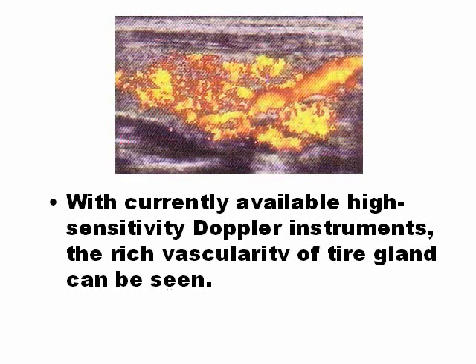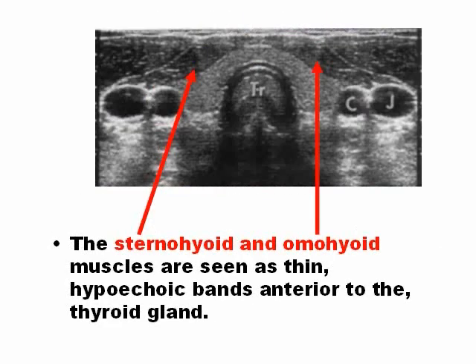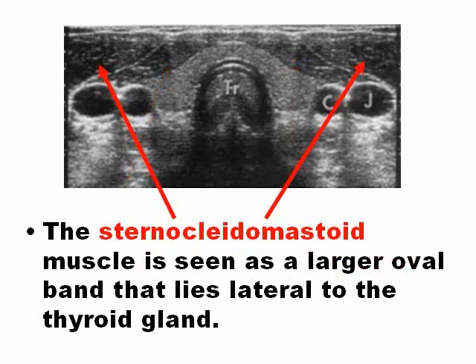This is an example of Power Doppler, and you can see the thyroid with a lot of color. The strap muscles are anterior to the thyroid; the most important are the sternohyoid and the omohyoid. The sternocleidomastoid muscles are lateral and anterior, and are a very important landmark for the localization of the thyroid gland.